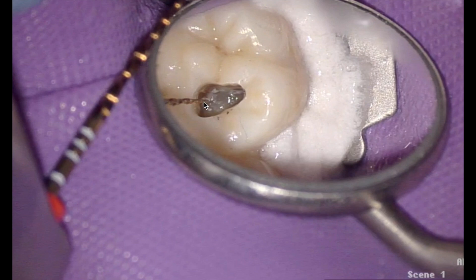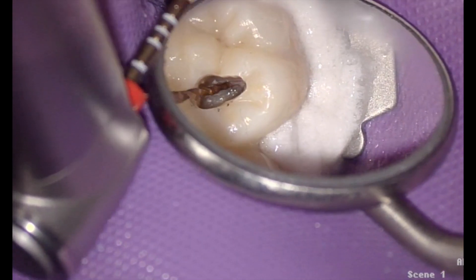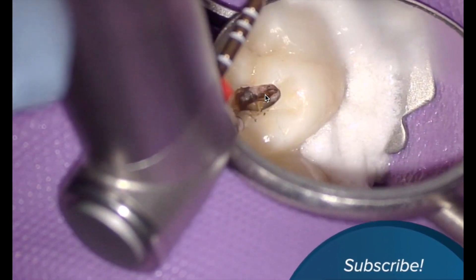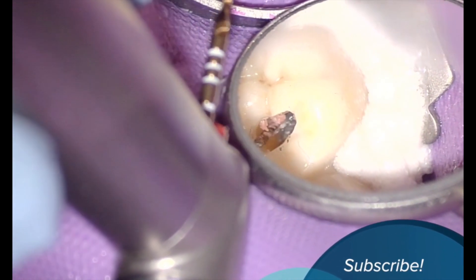I placed my explorer and only got two spots. This is a huge pulp stone calcification. Instead of using orifice openers — I never really understood them — I just take the WaveOne Gold Primary and use that as my orifice opener. It opens the orifice, but it also cleans and shapes the coronal two-thirds so I can get hand files down and tackle the apical third a lot easier. I'm only going to the cutting flutes — it's 16 millimeters.